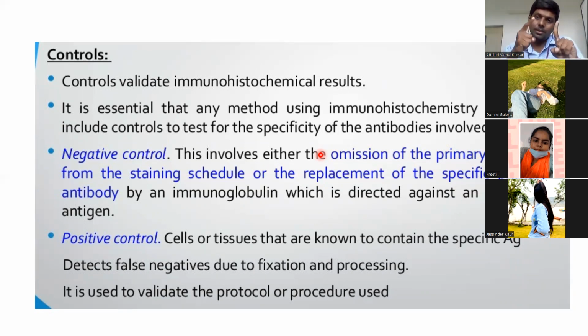How do I trust my antibody's binding property to the tissue? We don't know. Maybe there might be another protein resembling prostate antigen, and the antibody might bind it. We don't know to what antigen it exactly bound. We know that it is a specific antibody that will bind to a specific antigen, but still we can't trust this antibody. How do we prove that this is a proper binding site? How do we prove my test is correct?